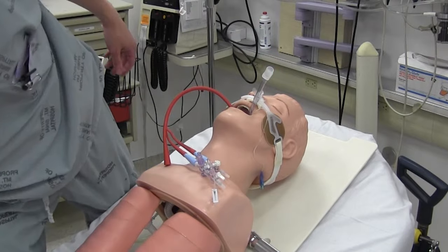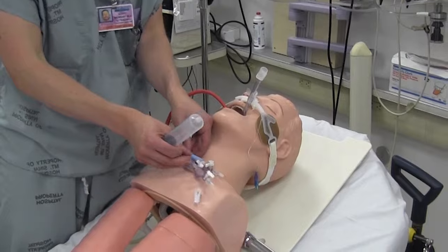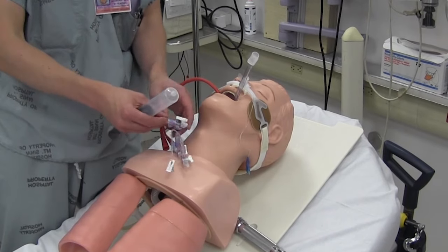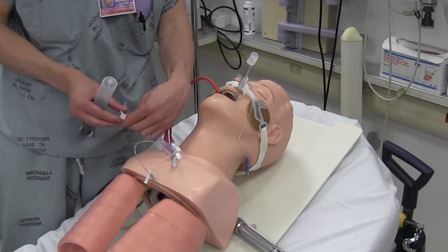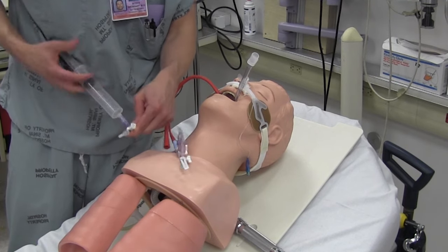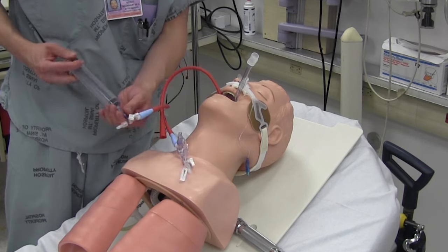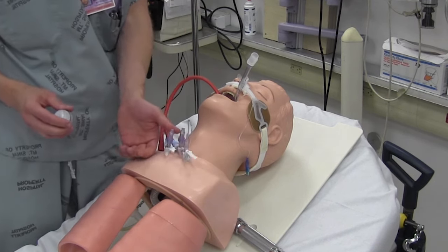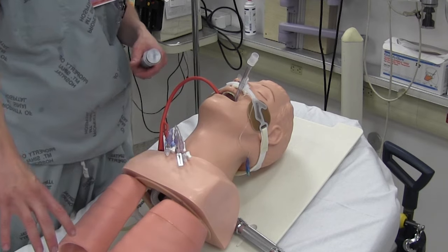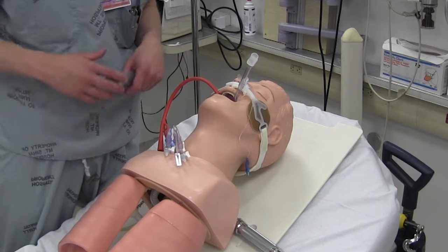We're going to put 50cc's of gas into the gastric balloon just to keep it from popping back out. Come over to this port, turn it away from the patient, put in 50cc's, and then turn it off to the patient. Now we're going to get an x-ray and make sure that balloon is sitting below the patient's diaphragm in the stomach before we do any further inflation.